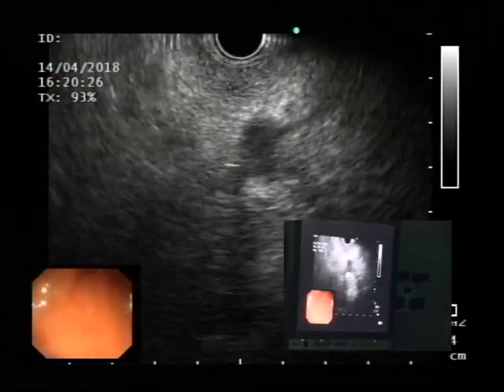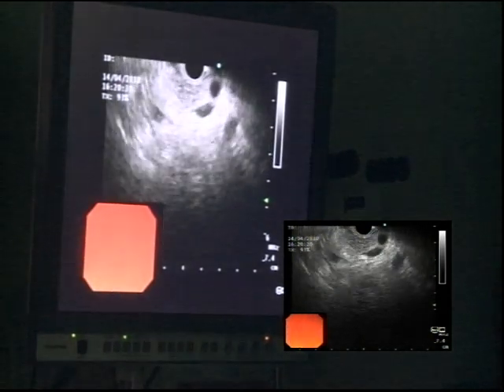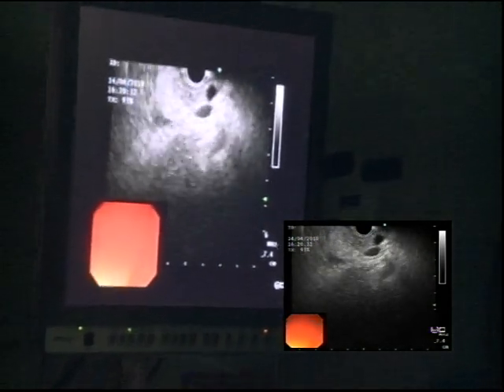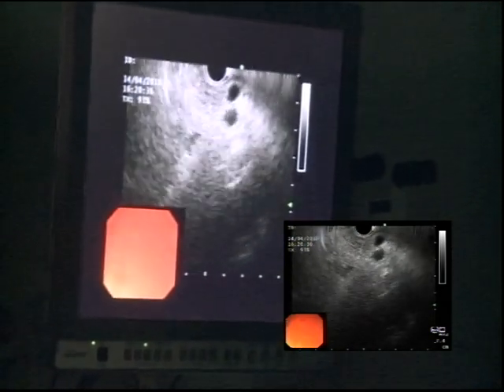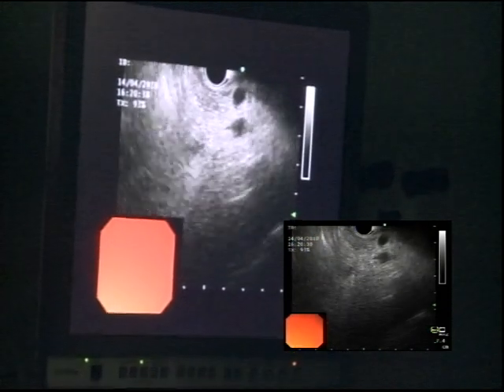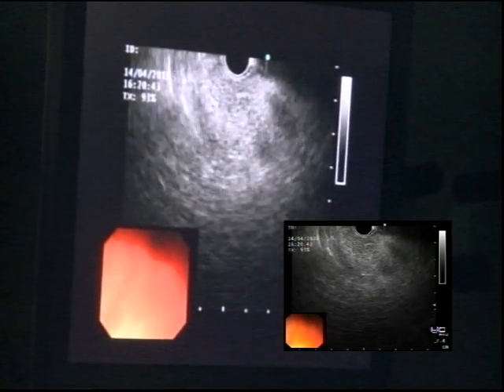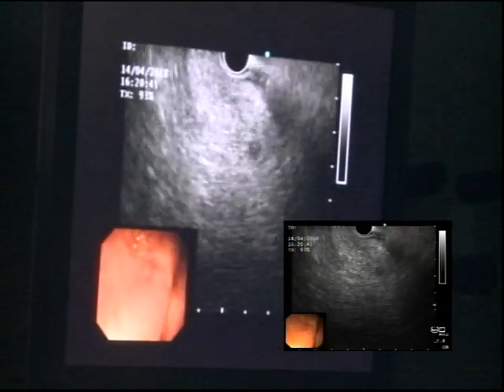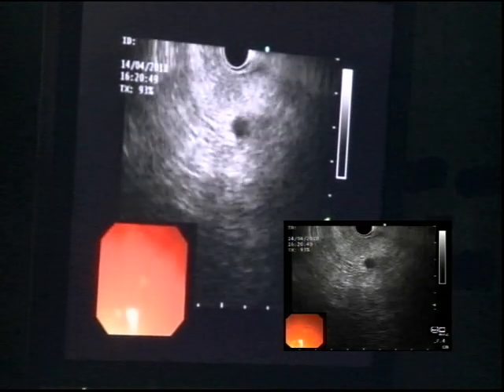Please. So now go clockwise and see if you can follow the pancreatic duct. Exactly. I can't see the pancreatic duct. Right. Yeah, relax your big wheel. So thumb away from you on the big wheel and go clockwise. And now you may or may not, but she may have a very normal, small appearing pancreatic duct. Right. And she has a lot of fat. The brightness tells you that there's fat inside.